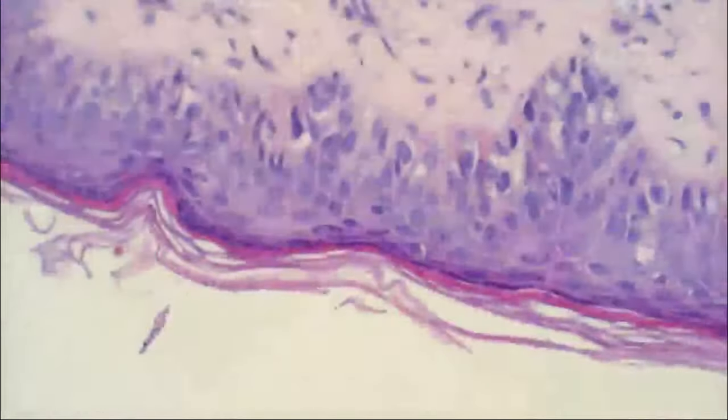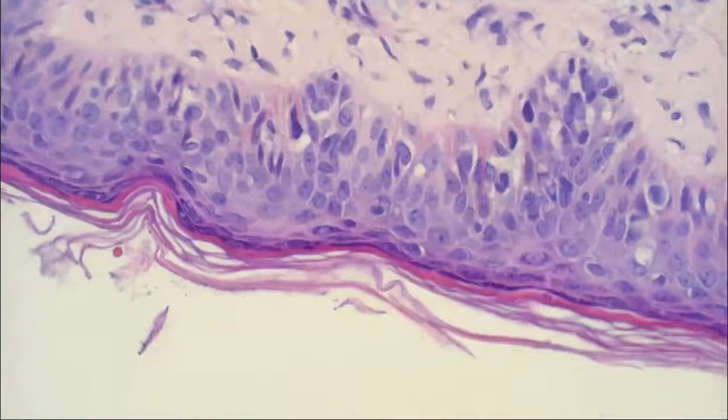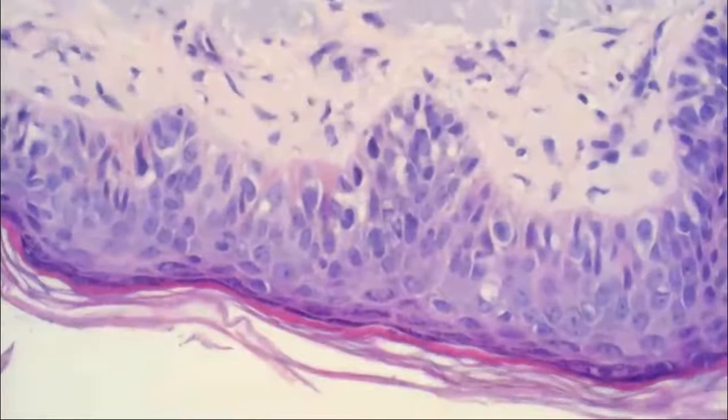Pagetoid carcinoma of the breast? Yeah, Paget's disease, that's right. And there's 2 types of that, right? There's mammary and extramammary. So that's in the differential. Probably wouldn't be extramammary unless they were outside without any clothes on or something for many years. That would be kind of unusual.